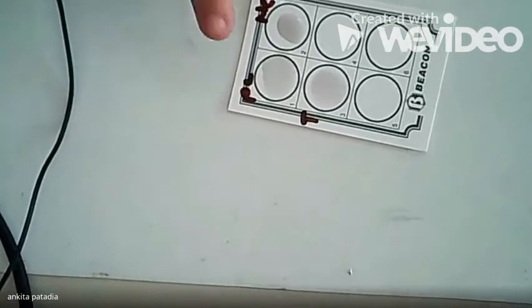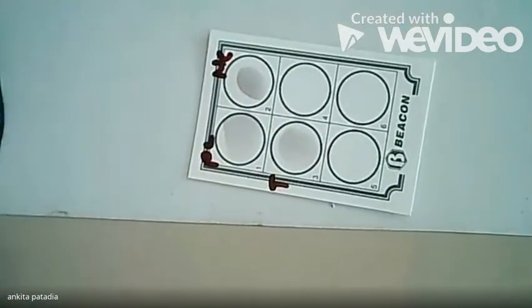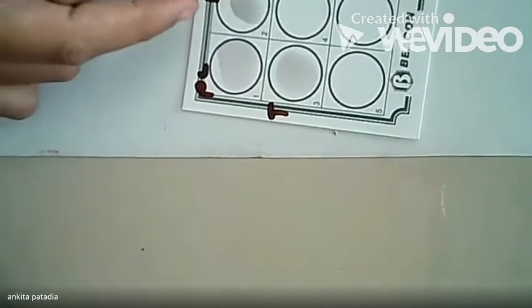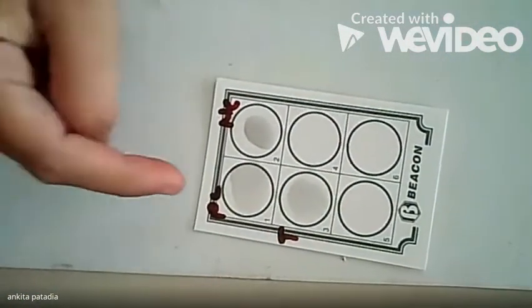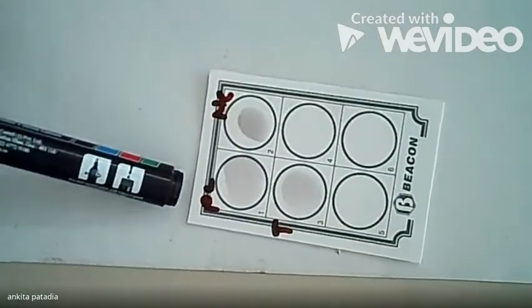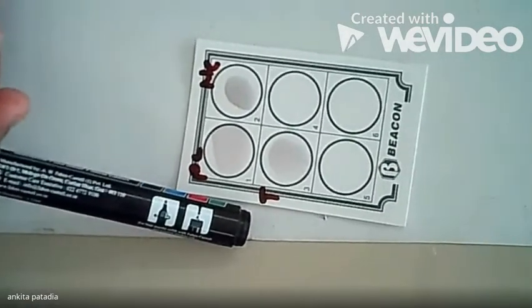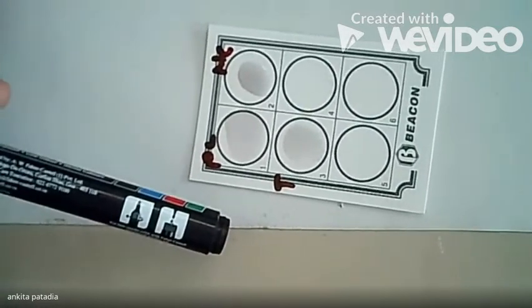This test is showing clumps. You can see that floccules are there. In negative control, no floccules are there. And in positive control, you can see the floccules over here. This is positive control, negative control, and test. In test, you can observe the floccules. So we have to proceed for the quantitative analysis to find out the titer.